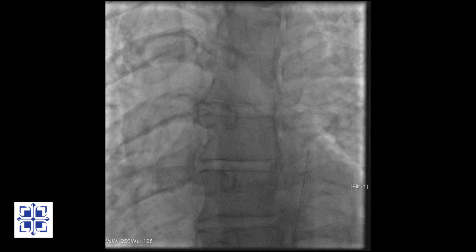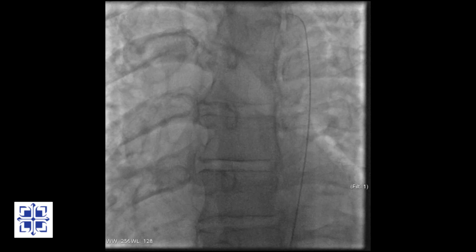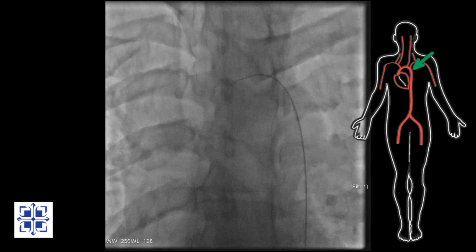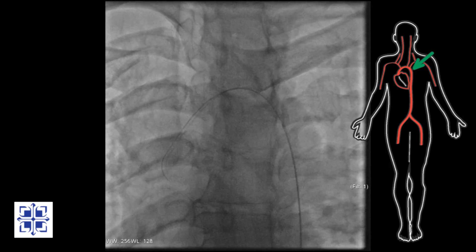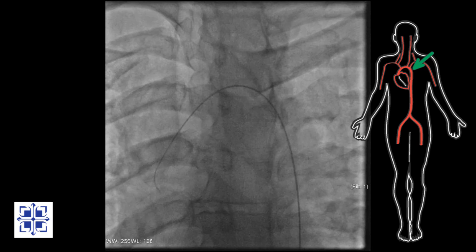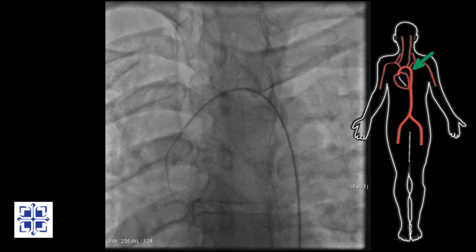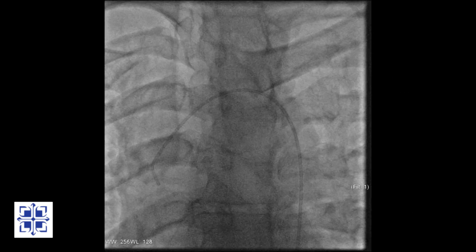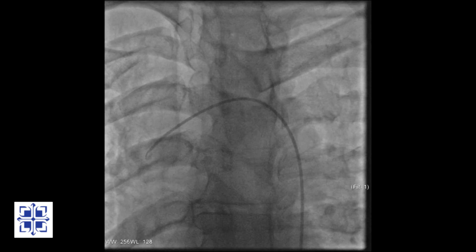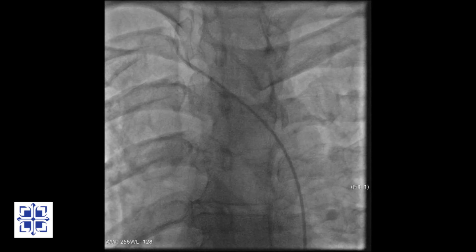I am advancing a catheter and glide wire inside the arteries from the groin to the chest. The wire helps to steer the catheter inside the body. When the wire reaches a destination — in this case the aortic arch — the catheter is pushed over the wire and the wire removed. The catheter, now hollow, is used to inject contrast, which lets us see the arterial branches.